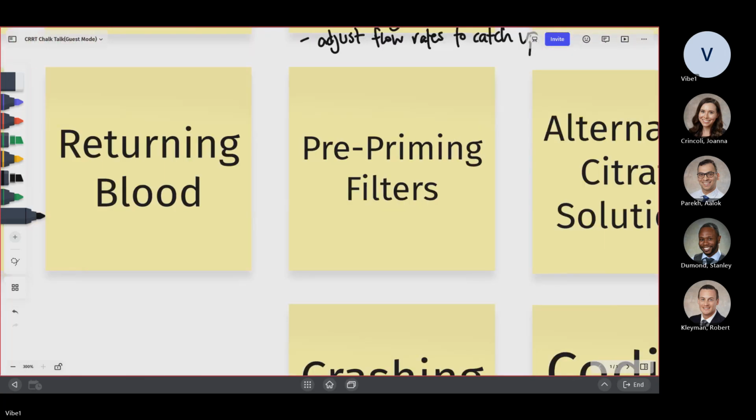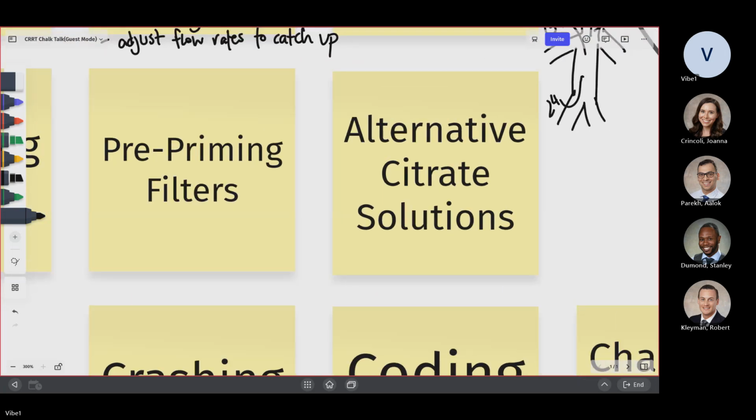The other thing you have to be careful about with CRRT is when you're running CRRT with hypothermic protocols, because you need to maintain the temperature around 32 on those patients. I think you have a dial on the CRRT machine, and the minimum it goes to is around 34 or something. You have to check it out. So sometimes you can actually put ice packs on the post line. You can cover it with ice so that you're able to at least minimize the temperature loss of what returns back to the patient. So that is one thing you can do.